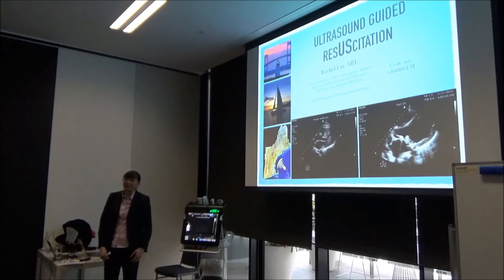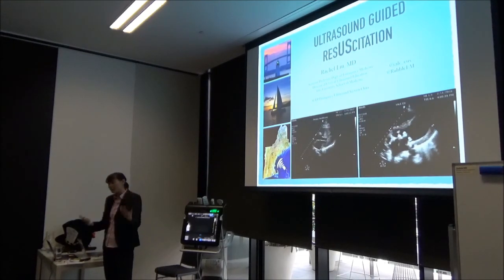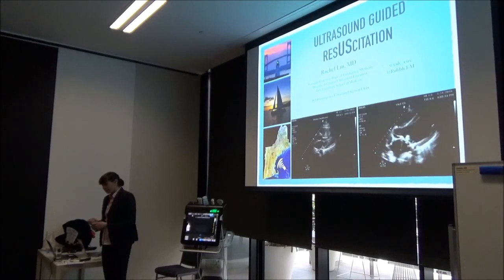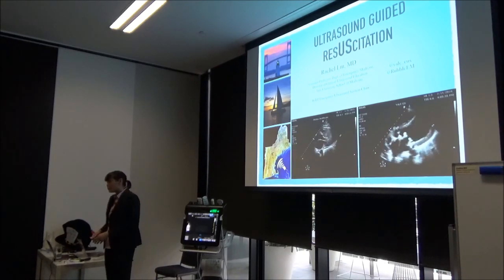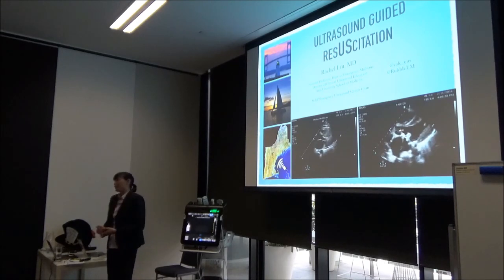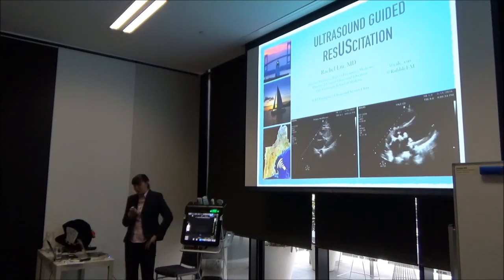In the whole planet. I think a lot of the reason why we as EM practitioners want to learn point-of-care ultrasound in the first place is for this very reason. Now, Arun just did a fantastic job of showing you how to get some views, including echo and lung. So a lot of this is going to be a review, and we're going to go through some cases. But these are a couple of images you haven't seen before.